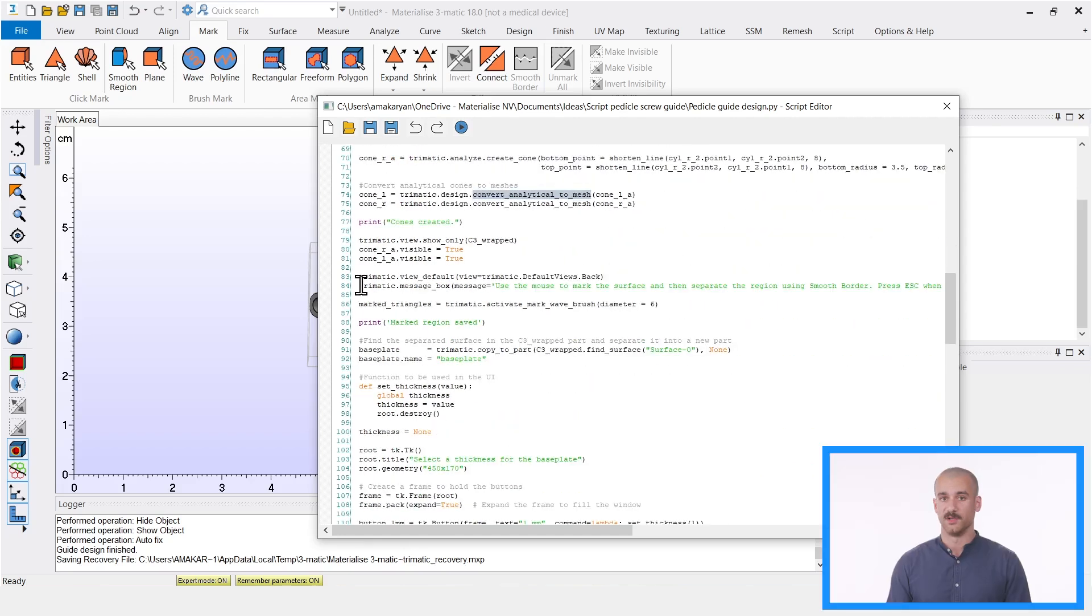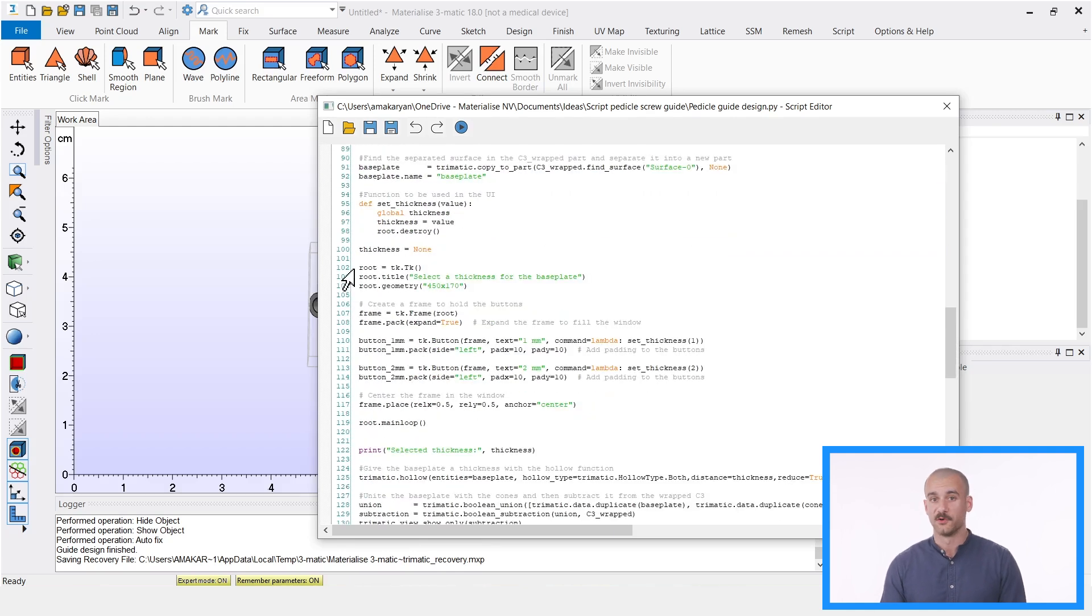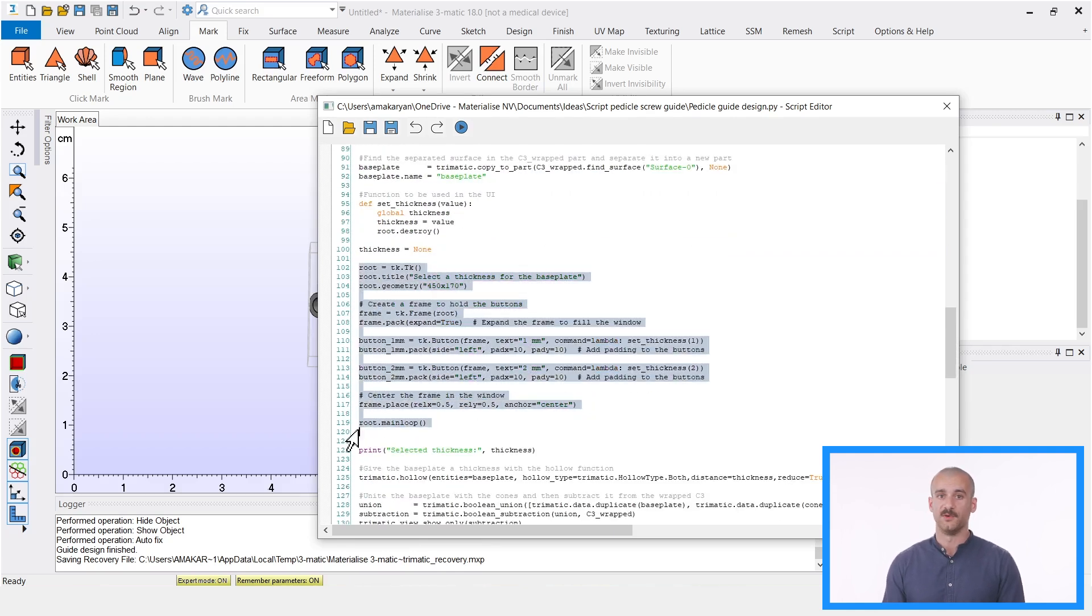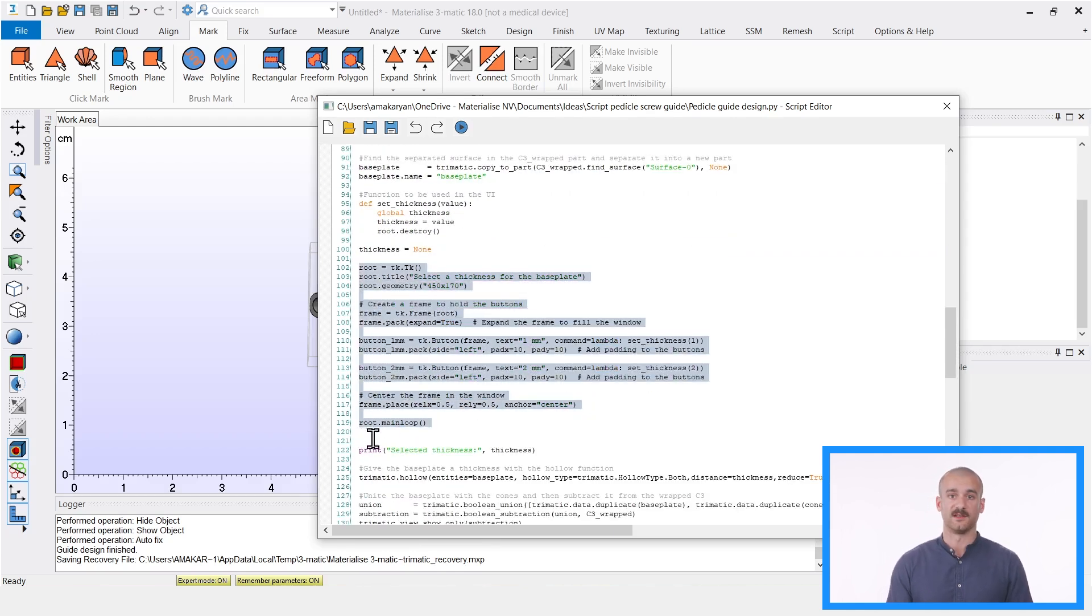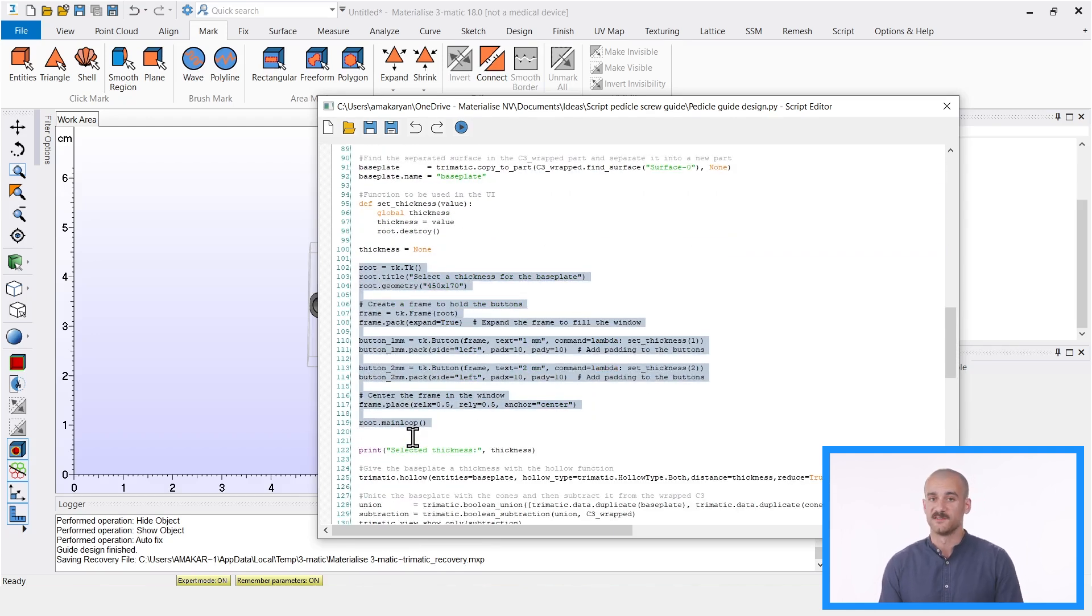Here we let a window appear with the instruction to mark an area to act as a base plate. And here's a code for making a small window with two buttons to select the thickness. And I actually use an AI assistant to help me out a bit with this.